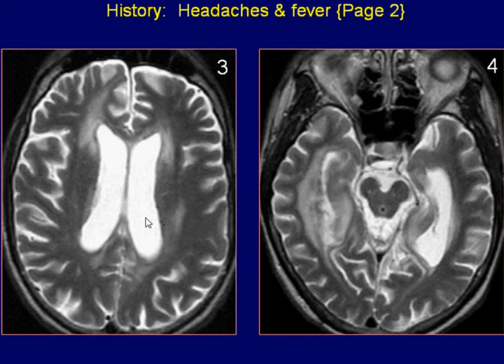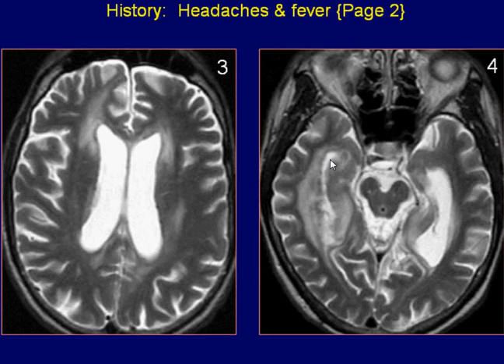The lateral ventricular system is prominent, with the exception of the right temporal horn that is normally slit-like in appearance.